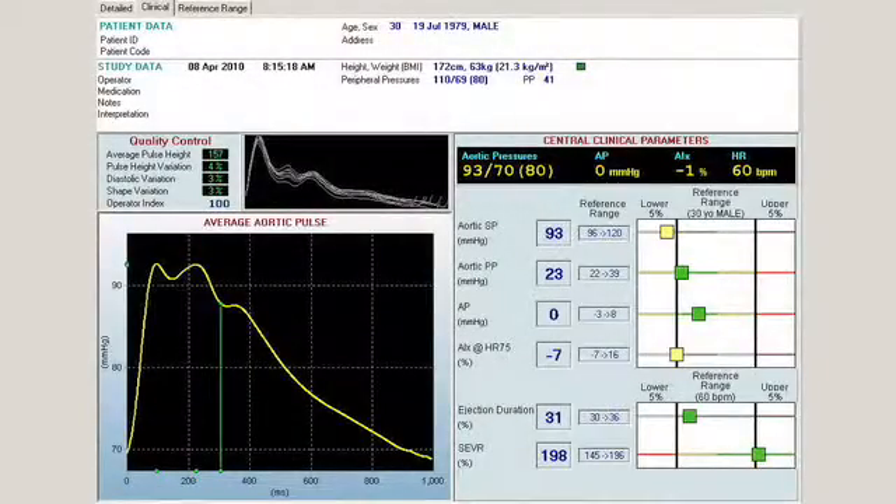The interpretation of these pressure recordings is of interest because we can see that on this subject — a young male, not overweight, with favorable peripheral pressures — brachially recorded at 110 over 69, his central pressures came in at 93 over 70, which means a very favorable aortic systolic pressure. His aortic pulse pressure is very favorable at 23, with the normal range being 22–39. From the Strong Heart Study, we know that an aortic pulse pressure exceeding 50 mmHg is associated with adverse cardiovascular prognosis. The augmentation pressure in our subject is also very favorable at zero, consistent with a favorable cardiovascular risk profile.